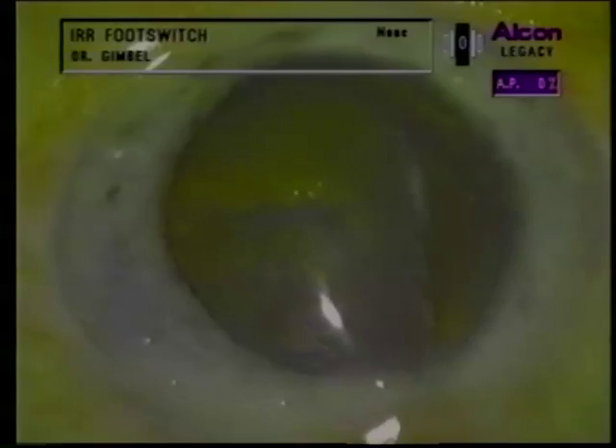The lens is depressed with a bent cannula to cleave the cortex from the capsule. Hydrodelineation can be performed with this bent cannula, or alternatively using a straight cannula. It is attempted on the left and on the right side of the lens, inserting the cannula between the nucleus and the epinucleus. This hydrodissection and hydrodelineation facilitates multi-directional divide-and-conquer and emulsification of the segments formed by fracturing.